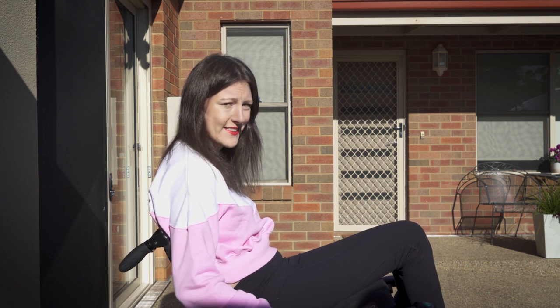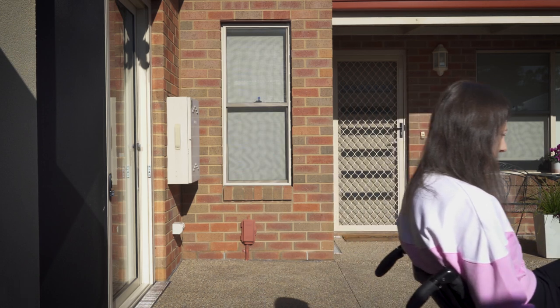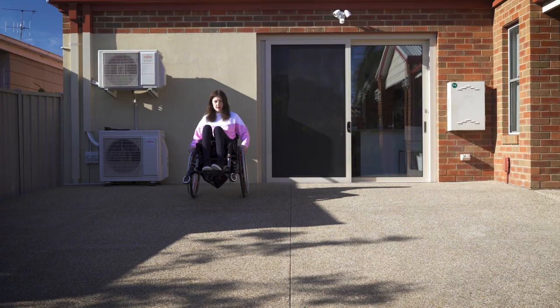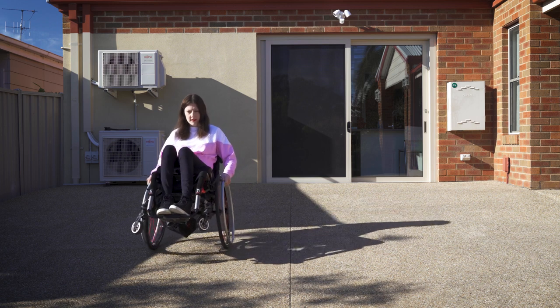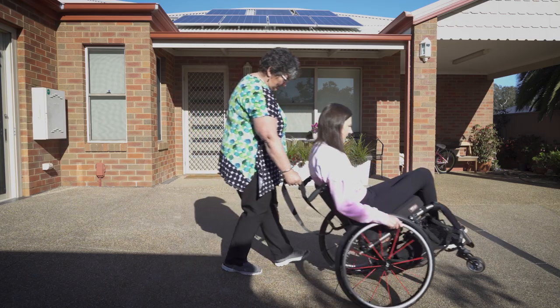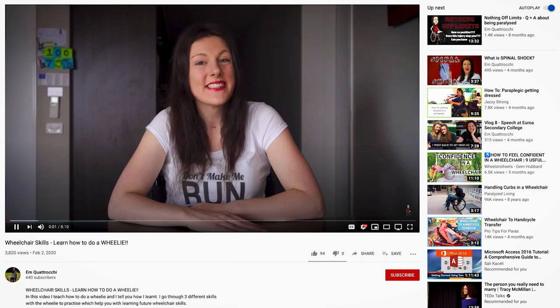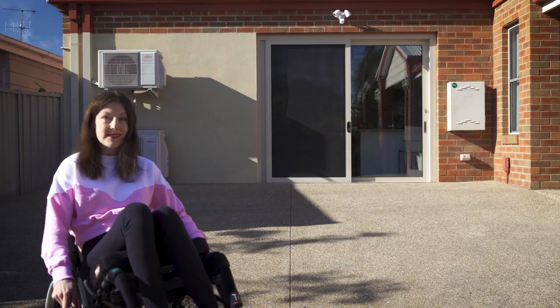So this is my favourite way to get down slopes — get into the wheelie and glide down. Remember the wheelie will feel slightly different from doing it on flat ground, so if it's your first time, get your friend to help spot you, which I explain how to do in my wheelie video. Once I reach the bottom, I can come down from my wheelie.